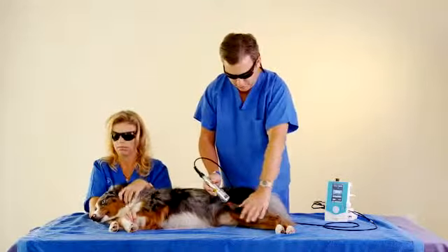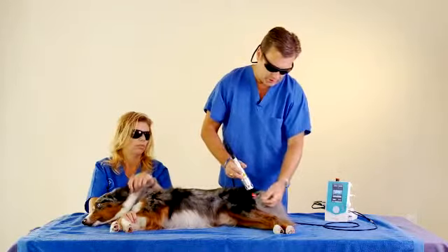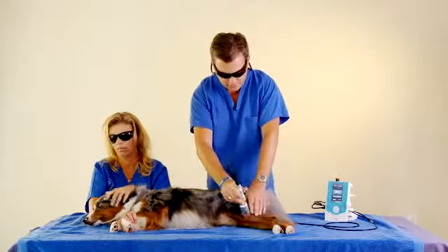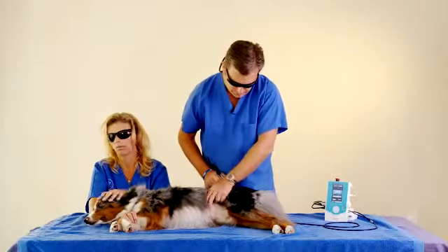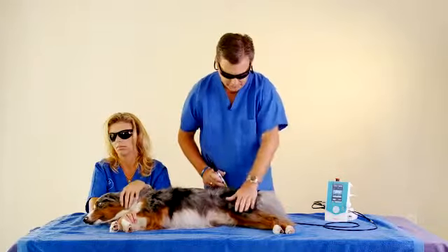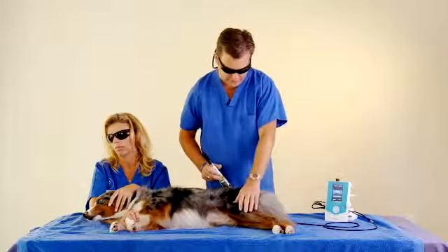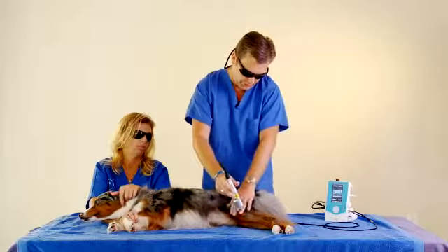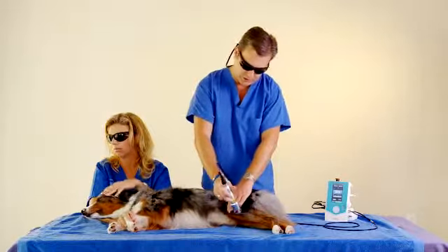And you also want to consider the coat color. This black hair is going to conduct the infrared light a lot more than this light gray hair would, or even the light brown or white. The white's going to conduct less. So the darker the hair and also the darker the skin, and this guy's got some really light skin, so you don't have to go nearly as fast. But if you have a chow where they have dark skin and possibly dark hair, you'd want to turn your laser down by about 40% to 50% less, or you'd want to move your handset faster, depending on the area you're treating. If you're not used to laser, turn down the wattage to half and go through two protocols instead of the one. You'll achieve the same thing.